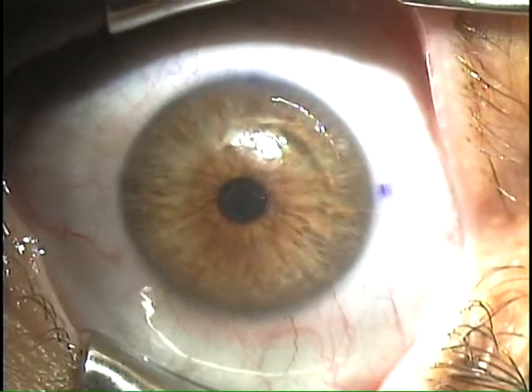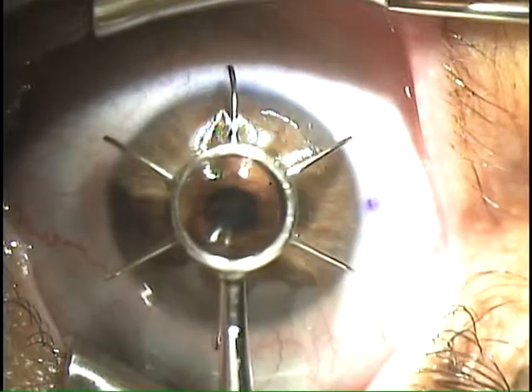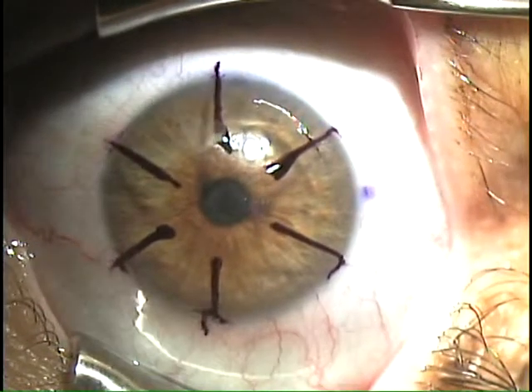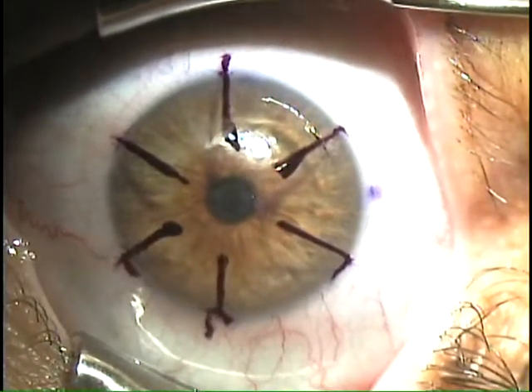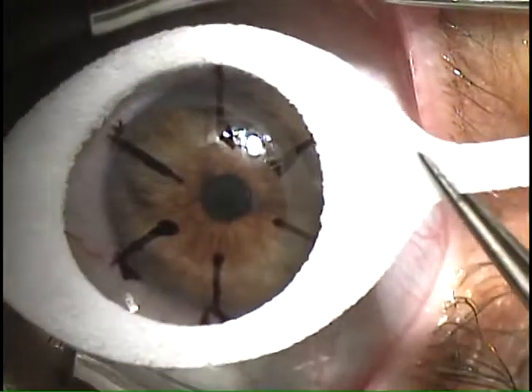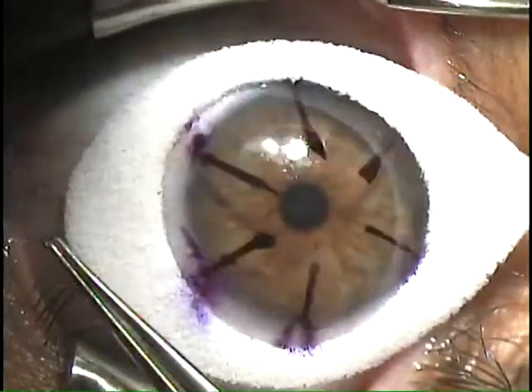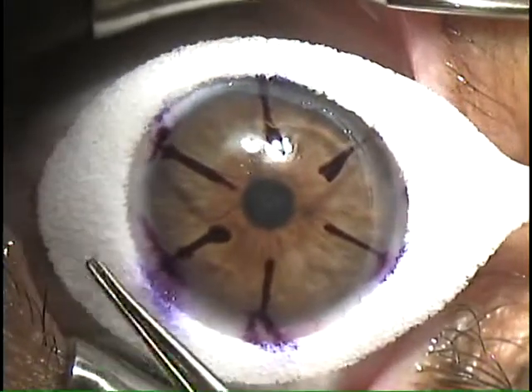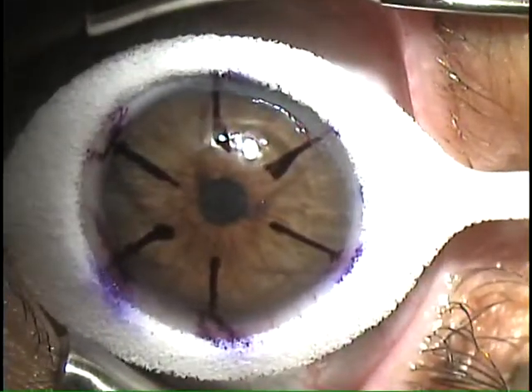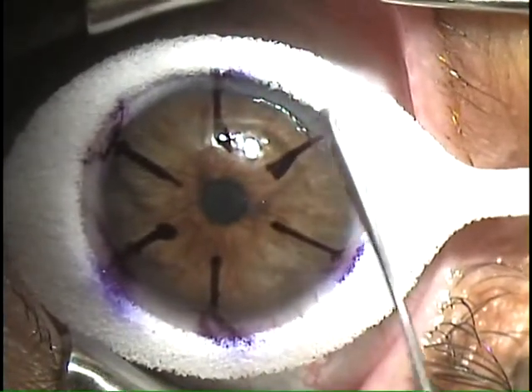We're going to make a mark first. Hold right there. Let me put this sponge down. Look a little bit to your right — that's good. We've already previously made this mark right here.